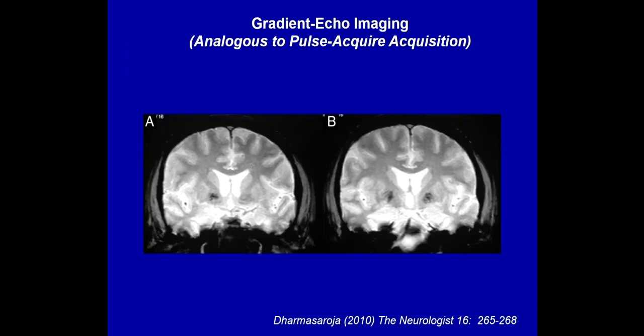And here is a gradient echo image. And see along here, this looks like a mouse chewed on the bottom of this person's brain. And that was not the diagnosis for this subject. See over here, same thing. There's distortions, but also big major signal loss down here at the base.